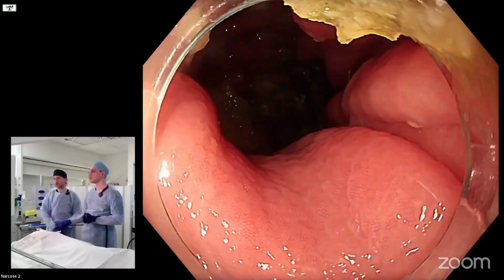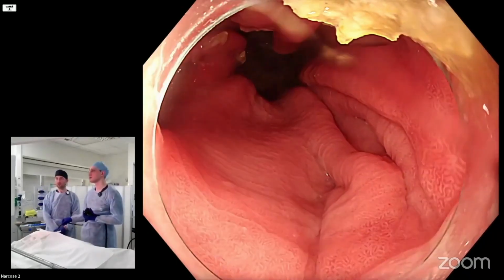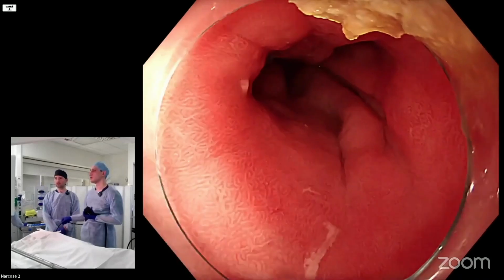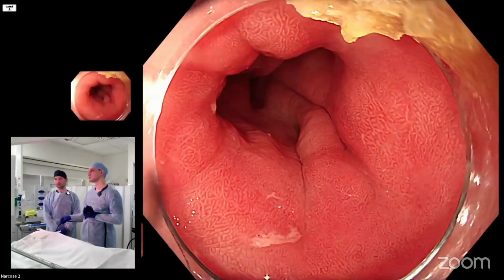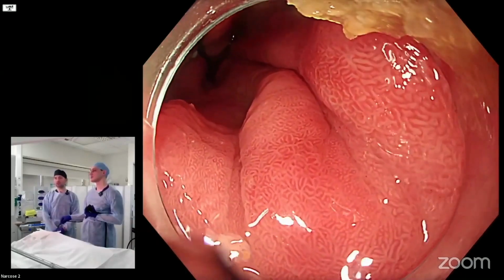Okay, so keep coming back. Keep coming back. Okay, where is the top of the gastric folds for you? Keep coming back. You need to see it entirely before we go further. So maybe I freeze the image. We can see here at 6 and 4 o'clock two folds, and we'll point this out later in the review images when we talk about breaking it down. But yeah, I think you're right. You can see it in the middle of the screen. So let's try and measure where that is.